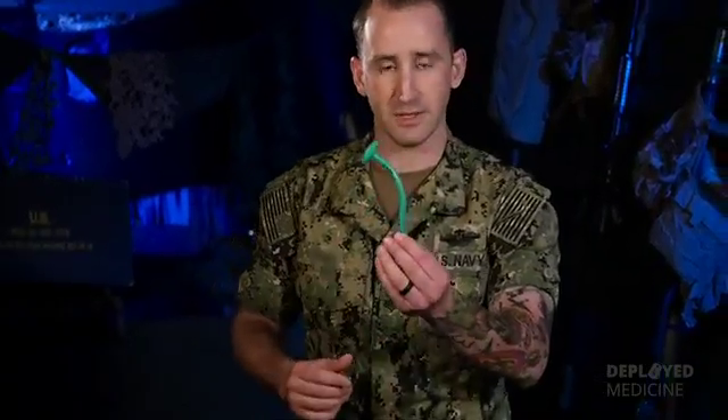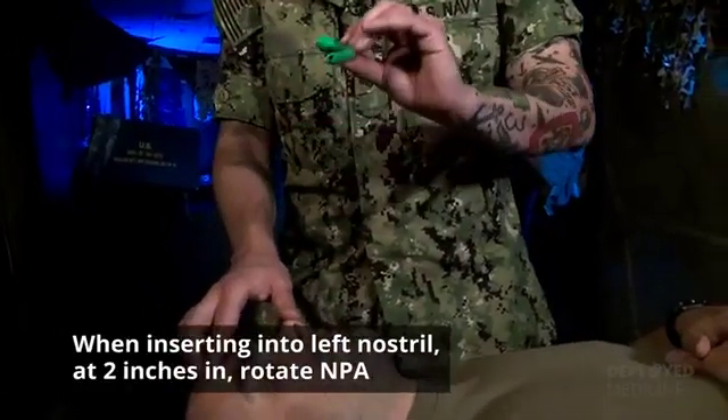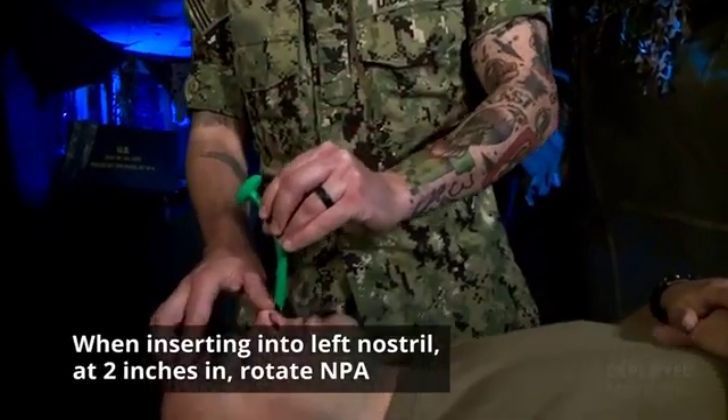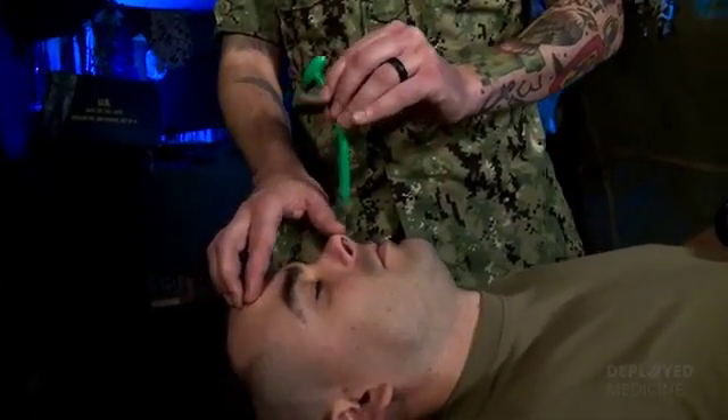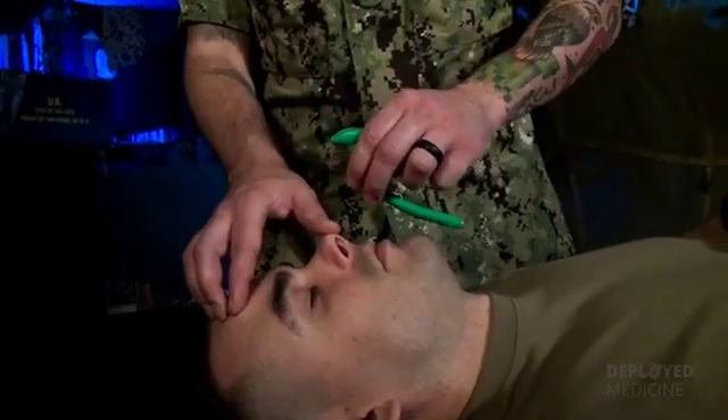You will also notice that the NPA is angled. When inserting it into the left nostril, after you get approximately two inches into the nose, you need to rotate the NPA so that the curvature is towards the patient's feet. This prevents the NPA from getting lodged up into the patient's throat or an area where it doesn't belong.